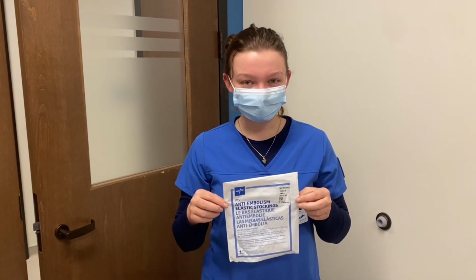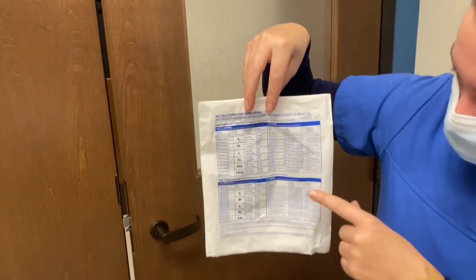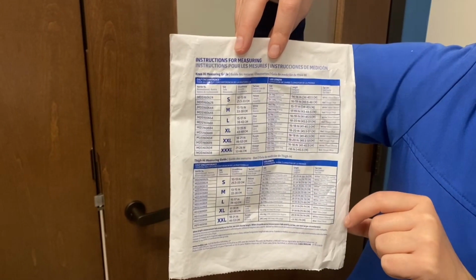So when picking out TED hoses, it's important to look at the back, at the chart here. It has calf circumference and leg length. And each of these correlate with which size you should choose for your patient. And if you pick out the wrong size, if it's too small, it can cut off circulation, which will harm the patient. And if you pick out a size that's too large, it'll be ineffective because it won't be a compression device.